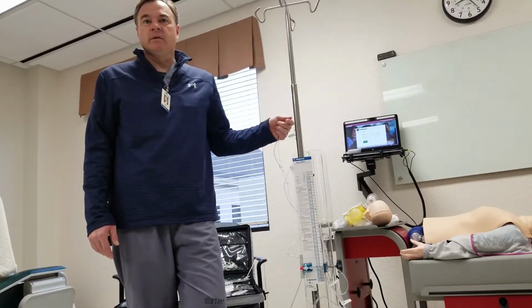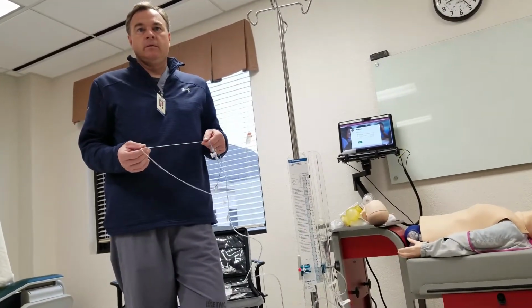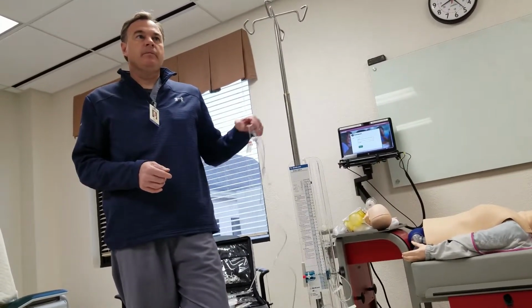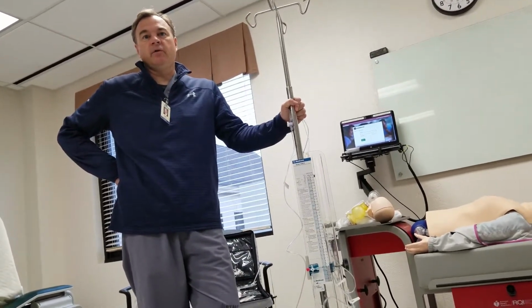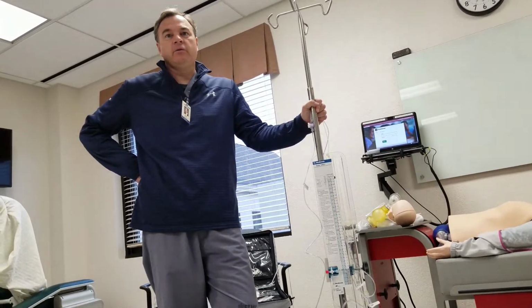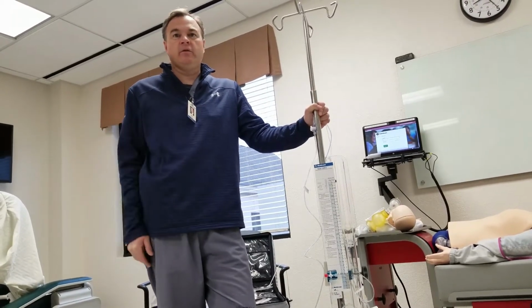Any other questions? How often do we need to check it, like if everything is doing fine? I guess, how often do you do your nurse's notes on the blood pressure intervention, like every hour. I think probably put it in sync with however you do vitals or blood pressure and whatever else. That's kind of your guys' internal thing.